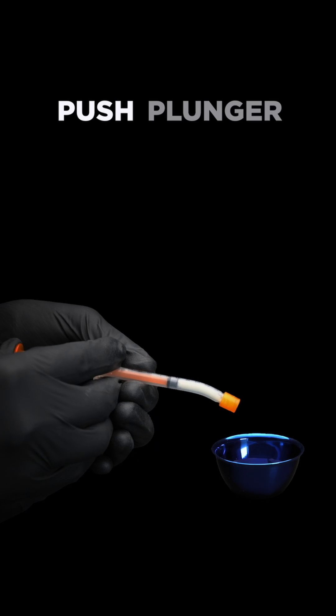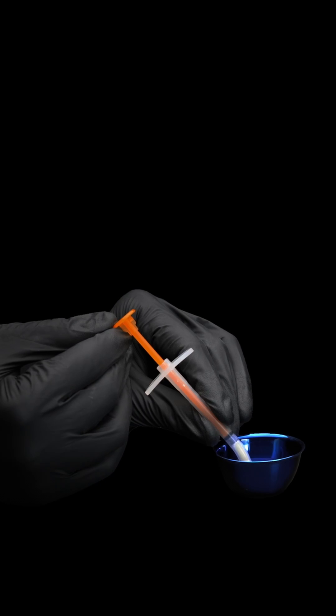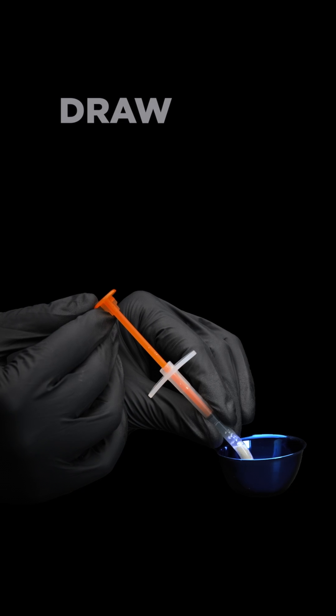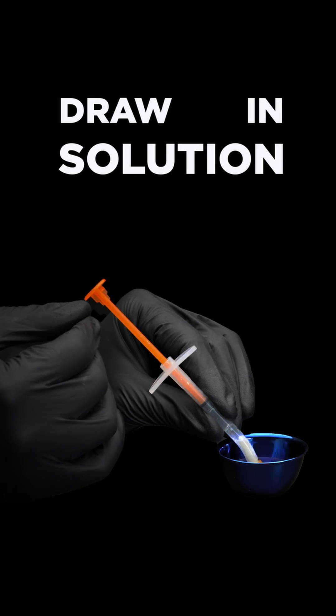Push the plunger inward to remove the excess air in the barrel. Fully submerge the orange cap into the solution and slowly pull the plunger back, drawing in the solution.